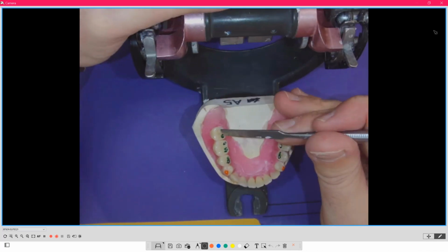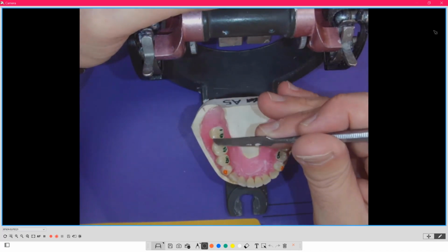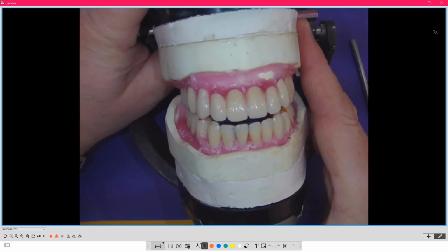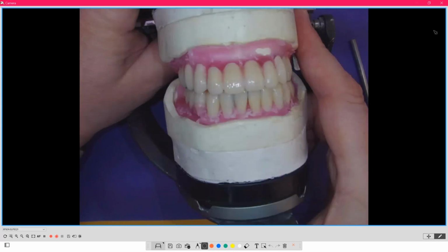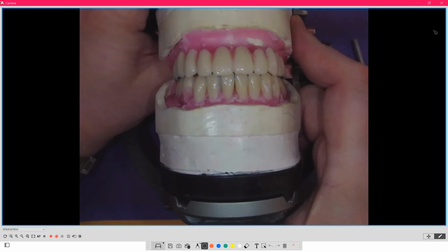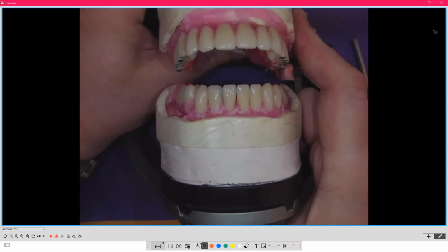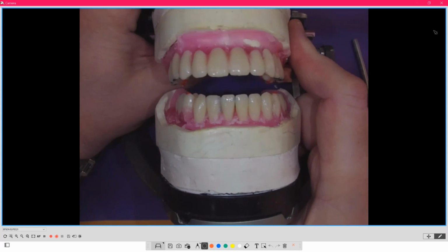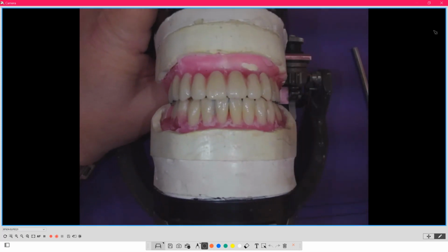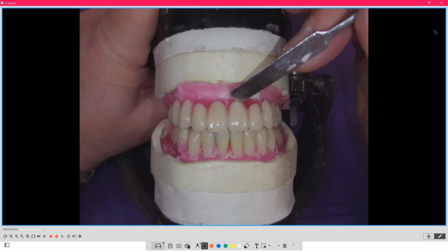You have to look for these marks, and then you can see them, and then I can adjust the denture tooth. So now for those patients that are swinging out into different types of chew patterns, I'm able to modify it. And then there's your freedom in Centric. So it has that little bit of wiggle room, and then I check the chew cycle.